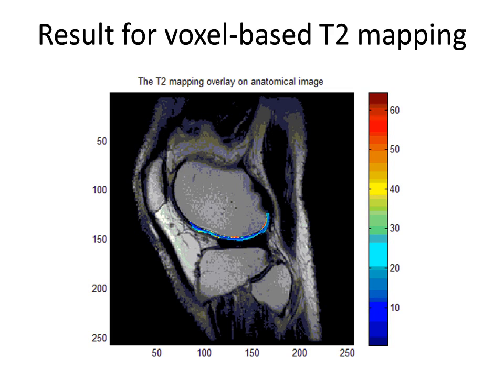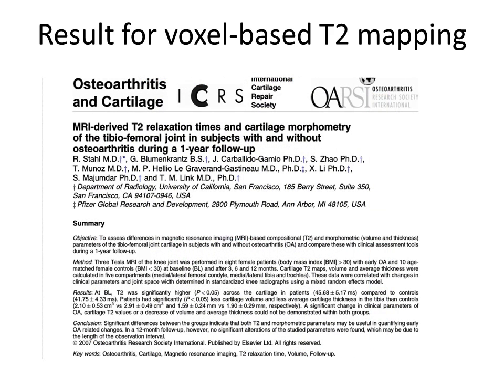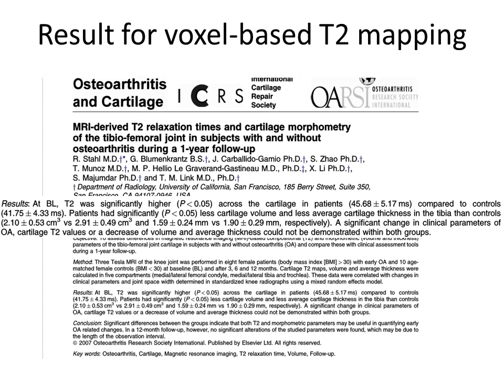That means the T2 values in the T2 map from my program are close to the T2 values of normal cartilage, as one paper indicates. So this is the paper. And in this sentence, we can see that the normal knee cartilage T2 time is around 40 milliseconds.